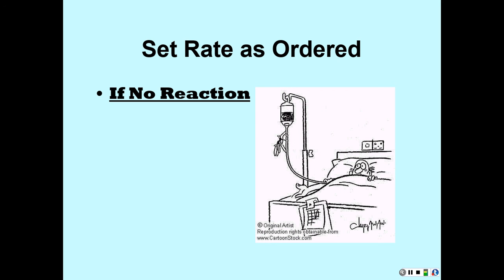You're not giving that while blood is transfusing. Okay, you need to be clearing out. You need to be having saline flowing through there. Okay.